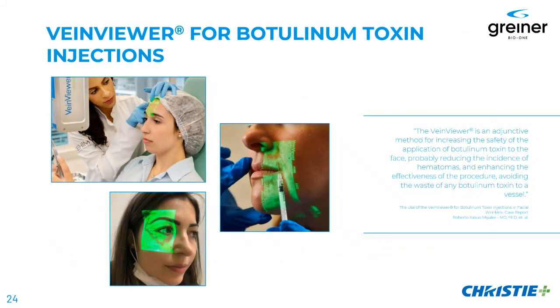Like I said earlier, specifically for Botox, the evidence also points to using this type of technology for Botox injections. Like I said, you can use it to map. You can actually use the device when you inject, or you could map the veins with a body pen and completely turn the light off, again knowing for sure where the veins are so you can avoid them.